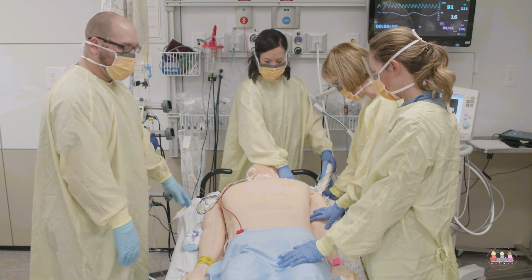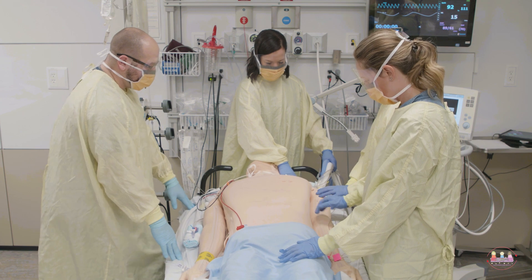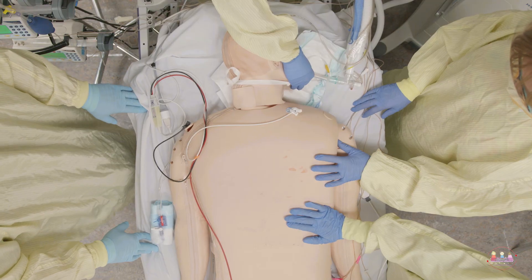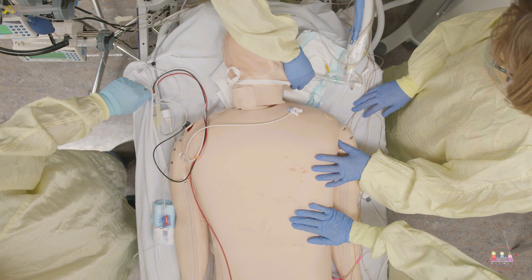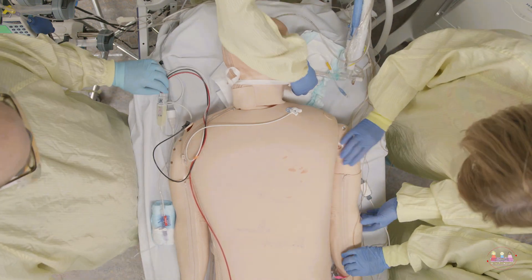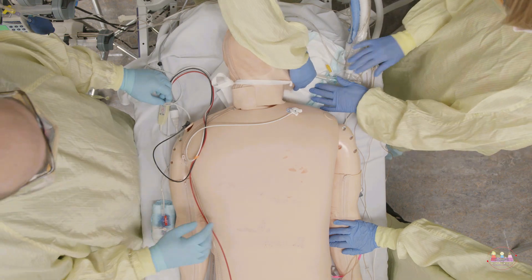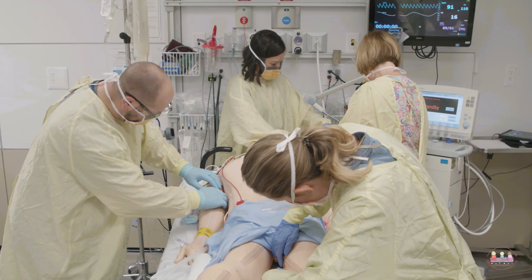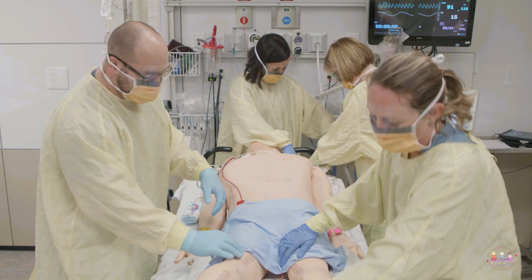The procedure should be carefully described to the child prior to and throughout the procedure. The bedside team should ensure the security of the endotracheal tube, all vascular lines and all other invasive lines. Any unnecessary tubes or lines are disconnected; however, the child should remain connected to the ventilator throughout the turn.